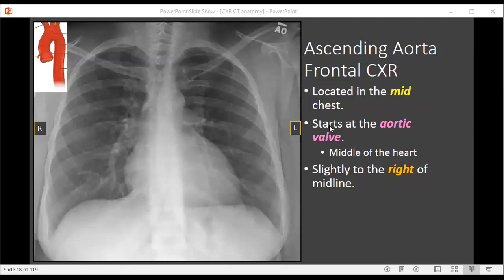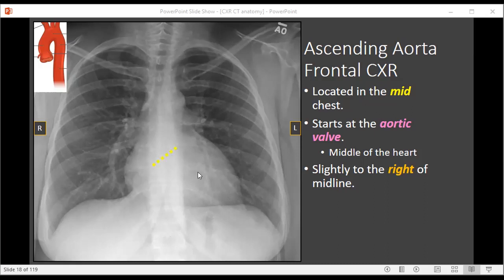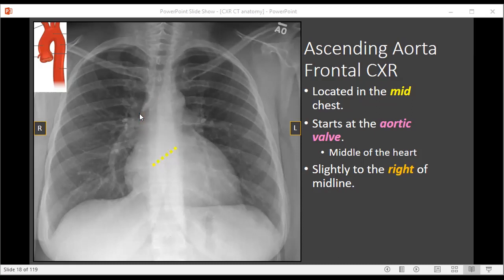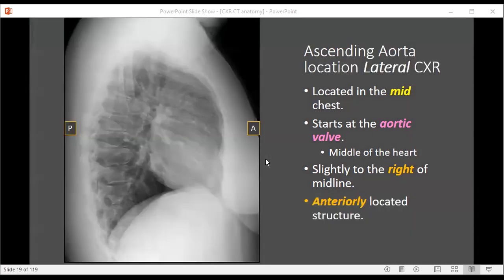Now let's talk about where the aorta is on a frontal chest radiograph. Remember on a frontal chest radiograph, right is actually the left side of the image and left is the right side of the image. Up in the neck is superior and down in the abdomen is inferior. The ascending aorta is going to be located within the mid chest, and it's going to start at the level of the aortic valve, which is located in the middle of the heart. The ascending aorta is located slightly to the right of midline, and notice how it could potentially create a small contour in the outer edge of the mediastinum just above the heart. On the lateral view, the ascending aorta will be anteriorly located in the mid chest, just above the heart.